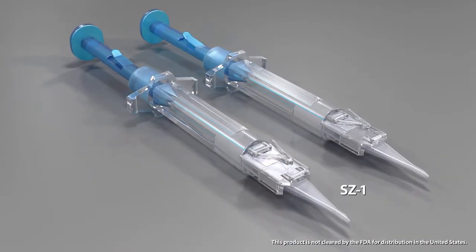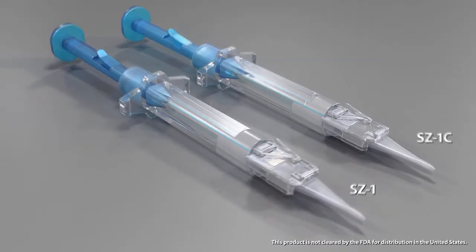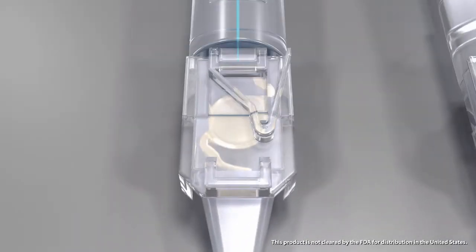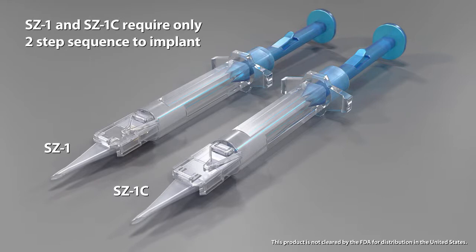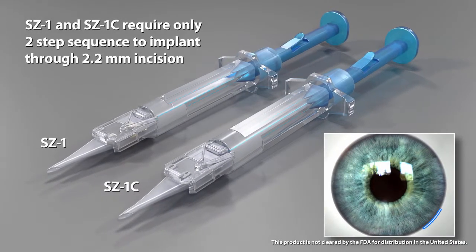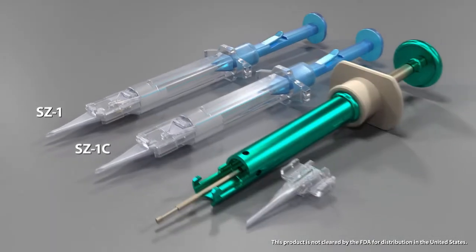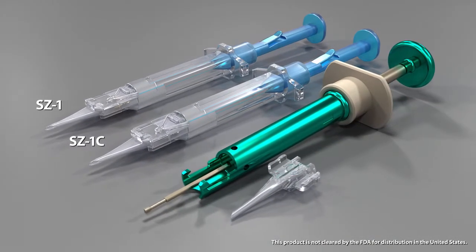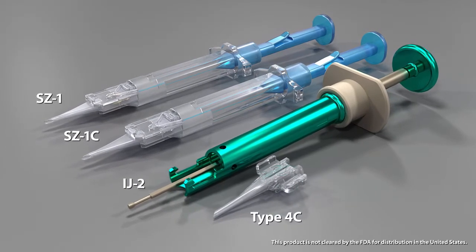The SZ1 and SZ1C are sophisticated preloaded systems, which feature an Actis SP in a disposable injector. Operation is quick and easy, requiring only a two-step sequence to implant the IOL through a 2.2-millimeter sclerocorneal incision. The Actis SP can also be used with the IJ2 reusable injector and type 4C cartridge.